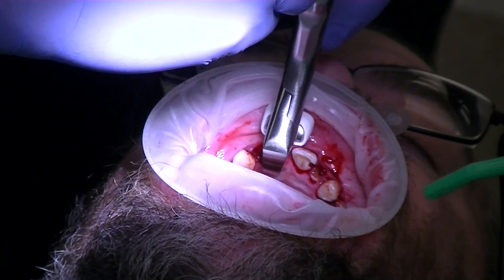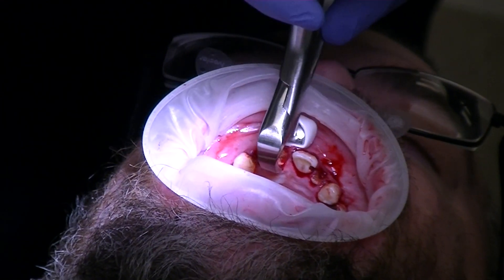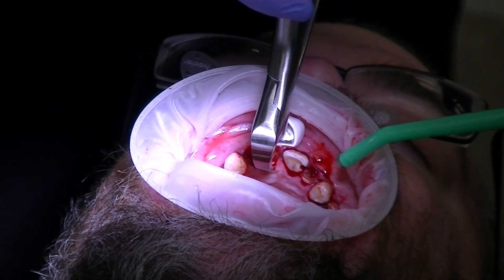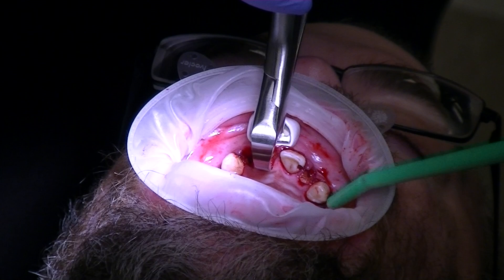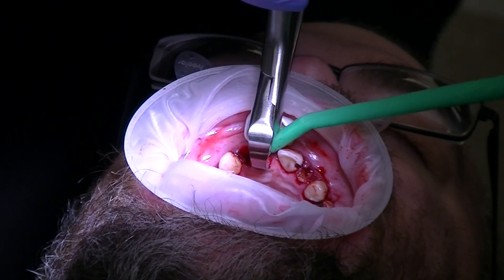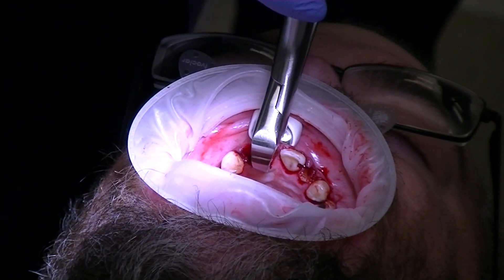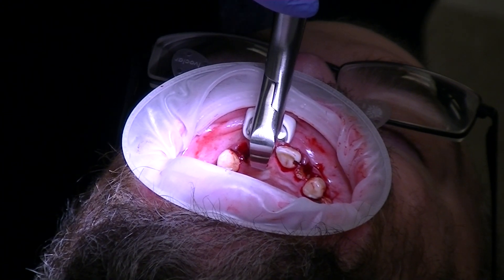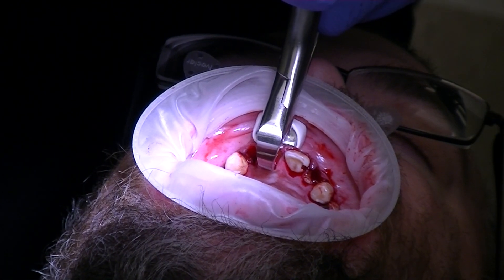Put the beak on solid tooth structure, and the bumper as high up into the vestibule as possible. Notice for a big guy he's got a very shallow vestibule, so the ratio of the fulcrum is not the most ideal, but we're going to make the best of it. I'm not squeezing any more than this — just enough to grab onto the tooth. Now we're going to rotate a little bit.